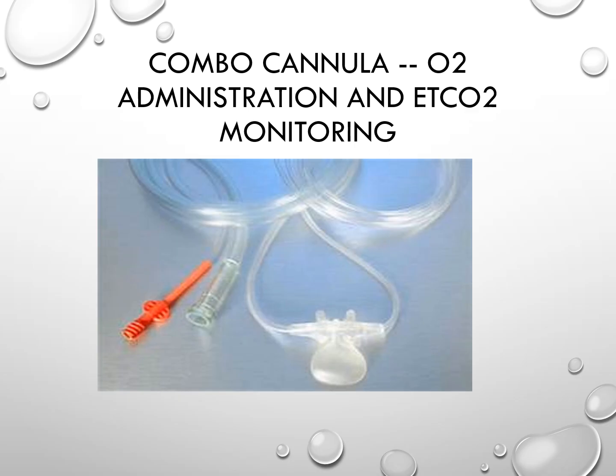So it may understate, or even grossly understate, the true value of the CO2 that's in the blood. Because again, I'll repeat this throughout the lecture, the value of end-tidal CO2 is the relationship between capnography and the partial pressure of carbon dioxide in the arterial blood. So again, these devices are extraordinarily useful, but it's not just that you slap it on the patient and go about your way. You monitor the patient and you keep these limitations absolutely positively in mind.